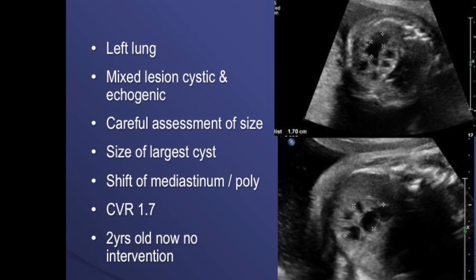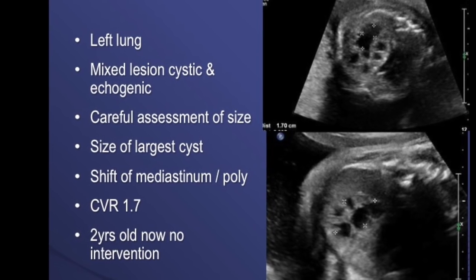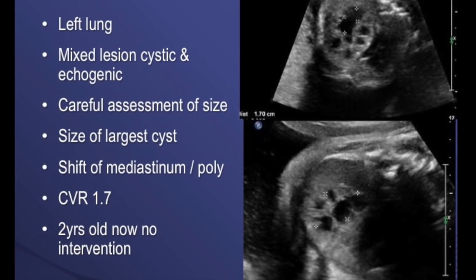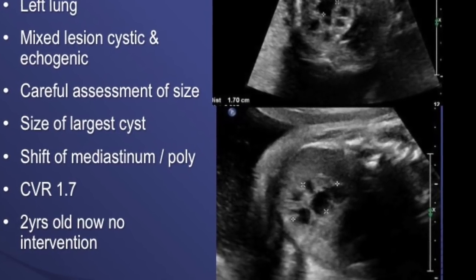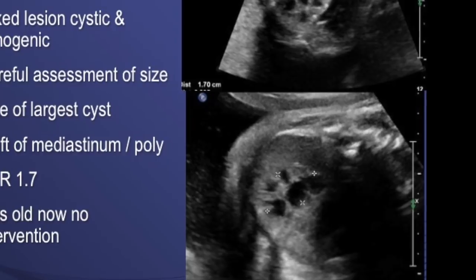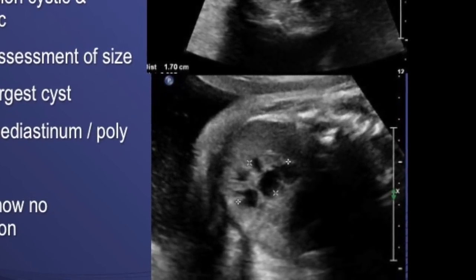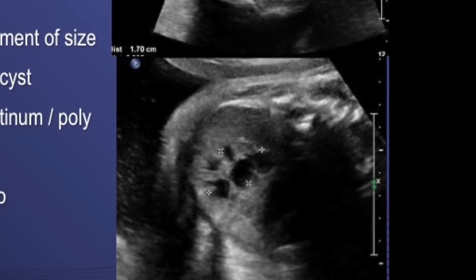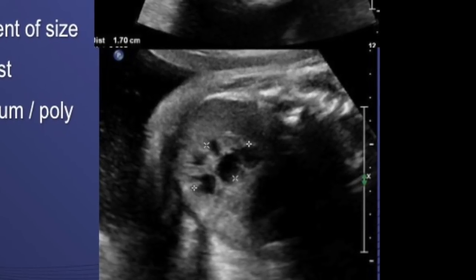This was another case of cystic CCAM or CPAM involving the left lung. This is a mixed lesion — cystic and echogenic. You have to do a very careful assessment of the size because some part is echogenic and you should include the entire lesion. There was a shift of mediastinum, there was polyhydramnios, and the CVR was 1.7. But this child is now 2 years old and there has been no intervention done.